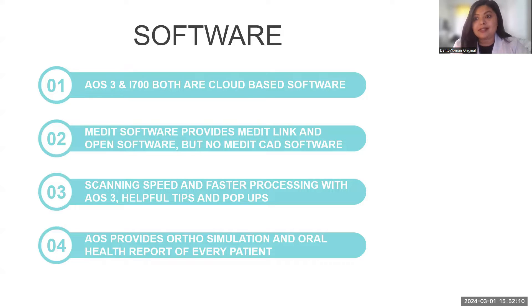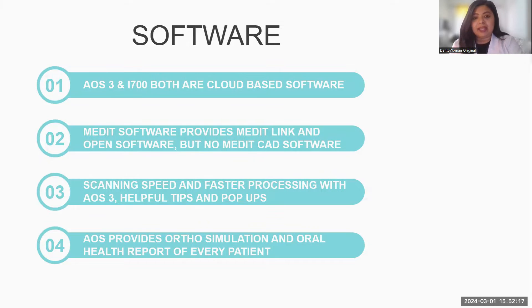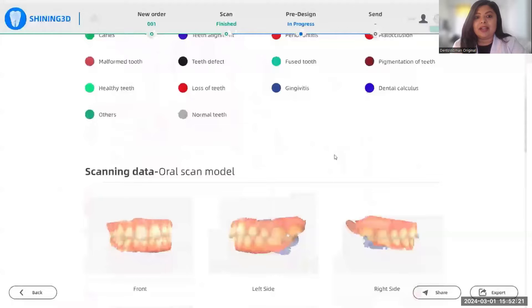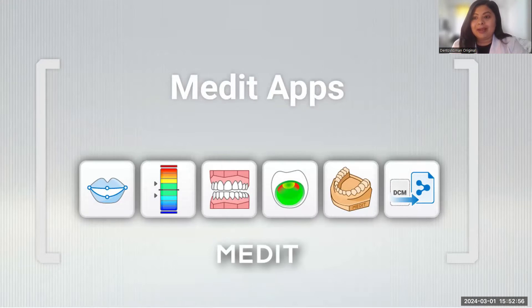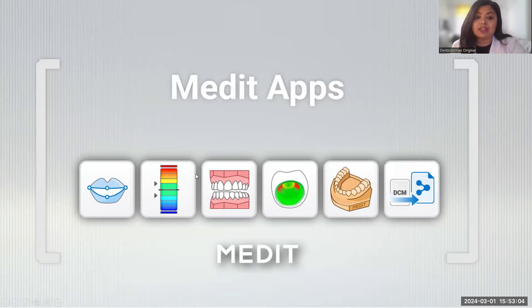Oral Scan 3 provides ortho-simulation and an oral health report for every patient. Ortho-simulation is also available in Medit i700, but the oral health report is exclusive to Oral Scan 3. After every scan, you can choose what to highlight for that patient and it prepares a full treatment plan — which tooth needs what treatment, the overall oral health of the patient — really helping clinicians educate and convince patients. Medit i700 also has multiple apps including smile designing, shade selection, model build-up, and auto-simulation.